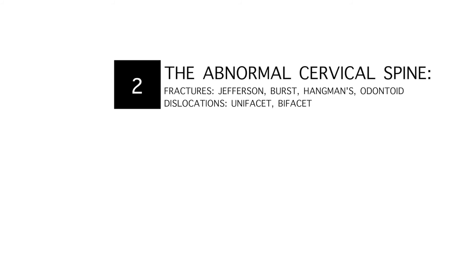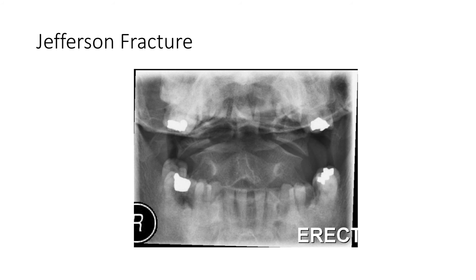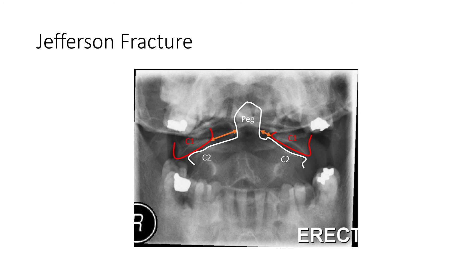To conclude, let's look at some abnormalities that you must be able to recognize on X-ray — first some fractures, then dislocations. Jefferson fractures are unstable compression fractures of the C1 bony ring. 50% are associated with other C-spine injuries and 33% are associated with C2 fractures. It is not usually associated with spinal cord injury. The mechanism is an axial blow to the vertex of the head, for example a diving injury. X-ray features are best appreciated on the AP open mouth view, which shows widening of the lateral masses of C1 beyond the margins of the body of C2. More than 2mm of lateral displacement or unilateral displacement may imply a C1 fracture.